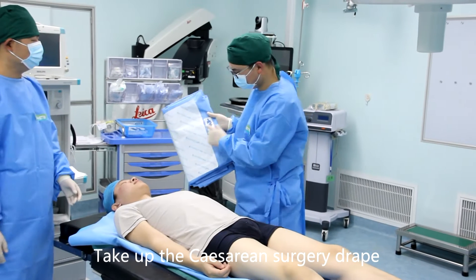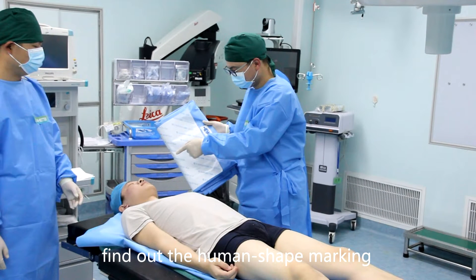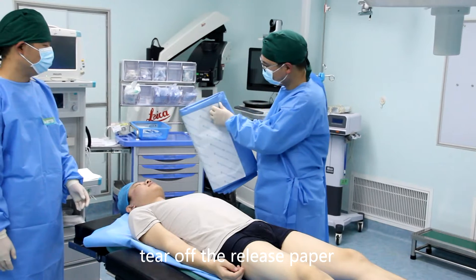Take up the cesarean surgery drape. Find out the human shape marking. Tear off the release paper.